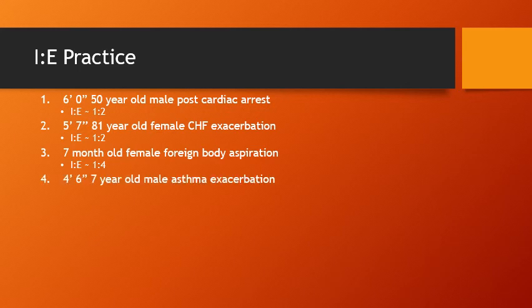Patient number 4 is our 7-year-old male with an asthma exacerbation. Go ahead and pause the video and decide what his I to E ratio should be.